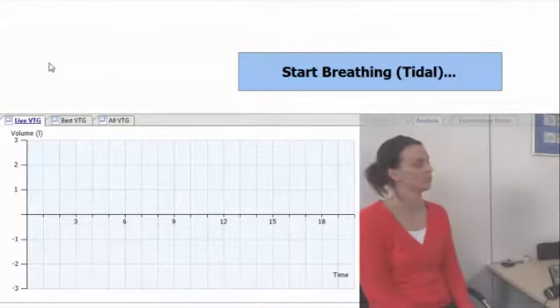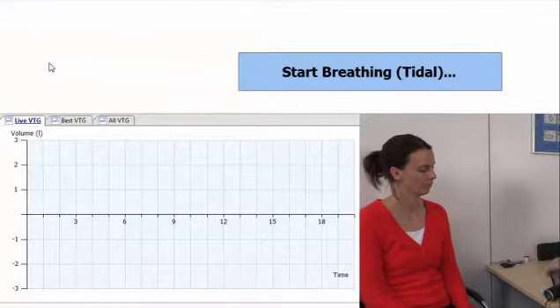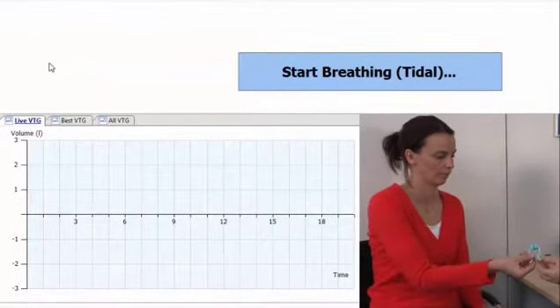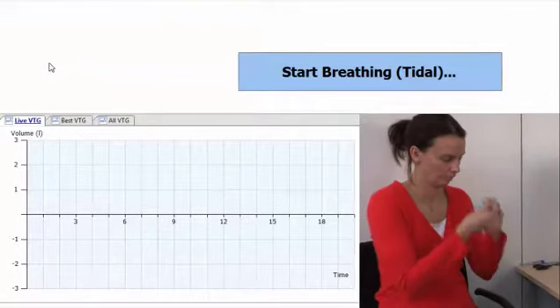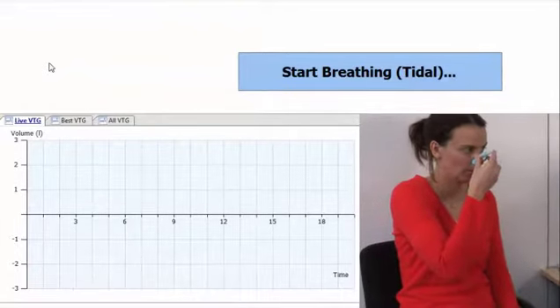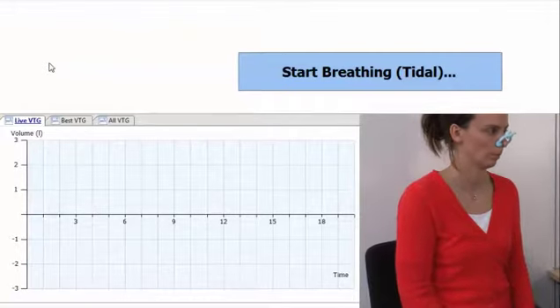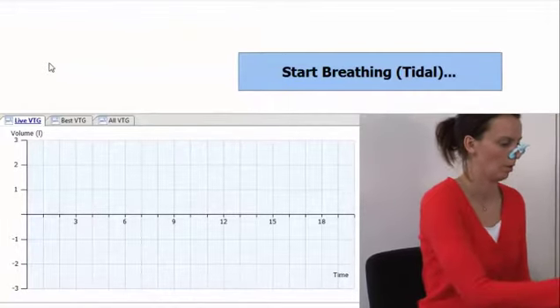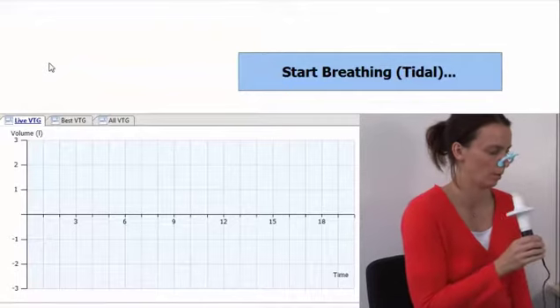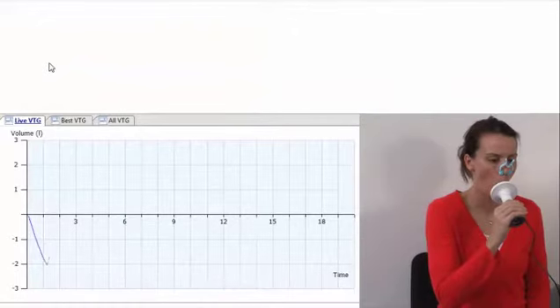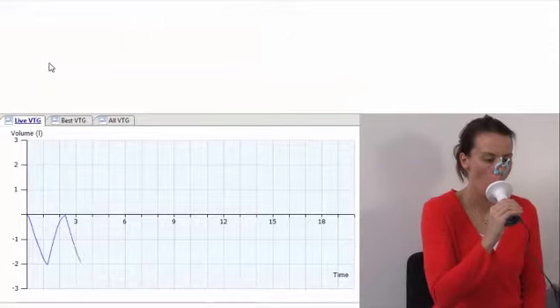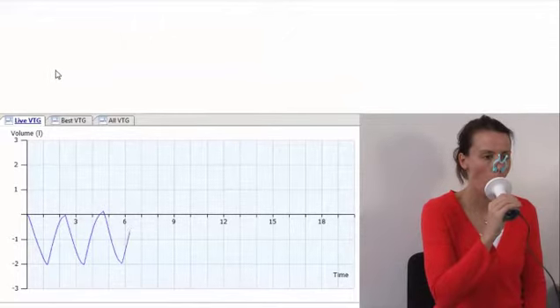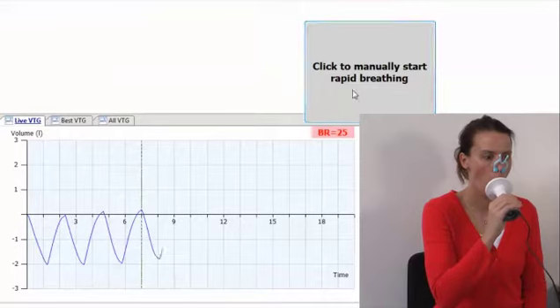Now I'd like you to start tidally breathing in and out. In and out. In and out. When you hear a beep and I raise my hand, start breathing rapidly in and out and keep going until I tell you to stop. It's crucial that you keep breathing in and out as fast as you can until I tell you to start.